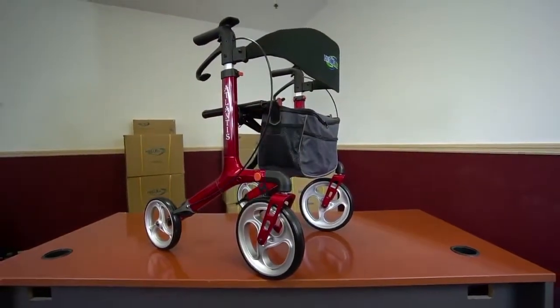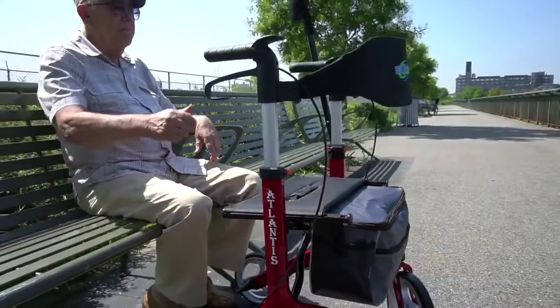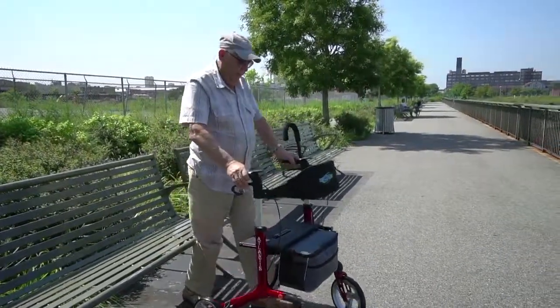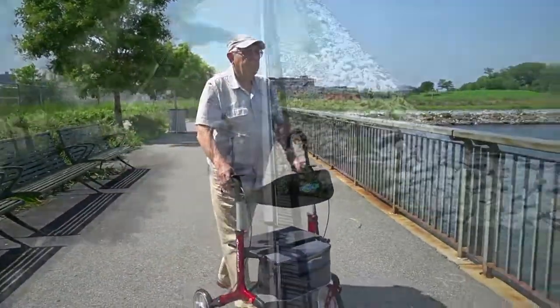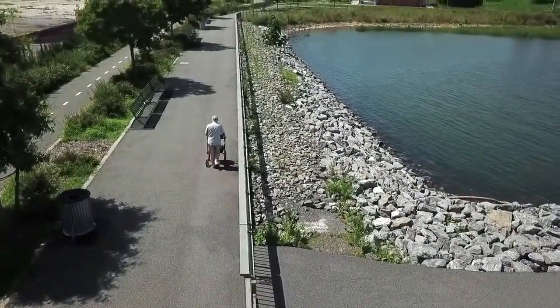Your Atlantis rollator is now fully assembled and ready to go. Maneuverable and lightweight, the Atlantis rollator weighs only 16 pounds but can support users weighing up to 300 pounds. The handles can be easily adjusted to your height with the unique push button.